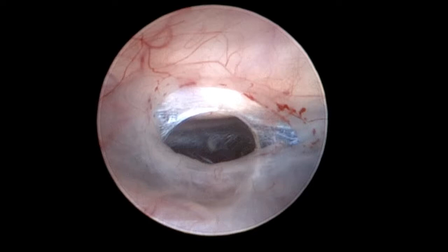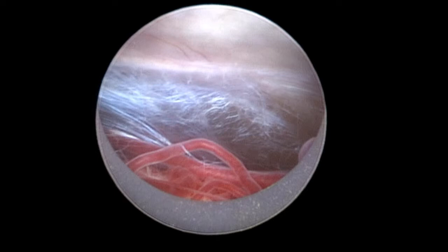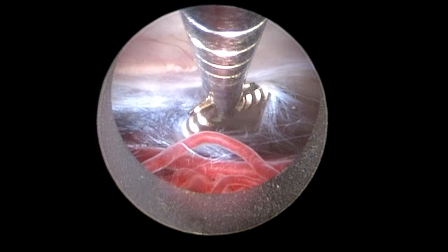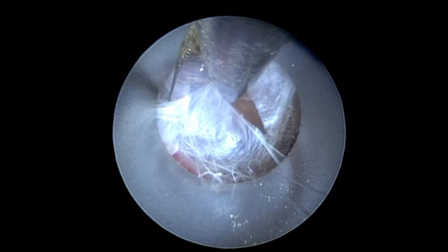After the fenestration has been achieved, the endoscopic sheath of the Little Lotta endoscope is introduced via the third ventriculostomy into the prepontine cistern. Inspection shows an additional membrane deep down in the prepontine space. This membrane is perforated with the DEC forceps and the perforation is enlarged by spreading the branches. Additionally, scissors are used to cut the membrane to create a wide fenestration, which is necessary to allow sufficient prepontine pulsatile CSF flow.